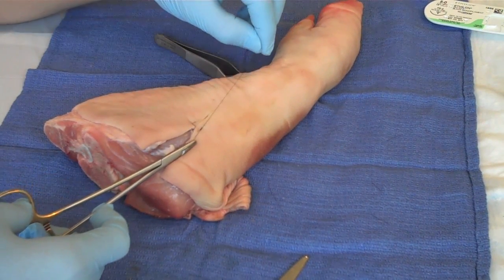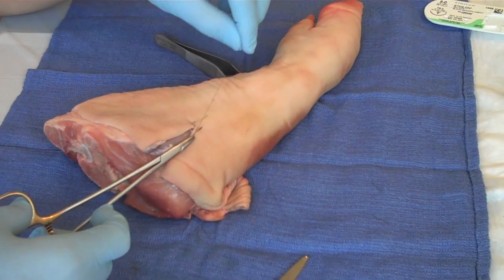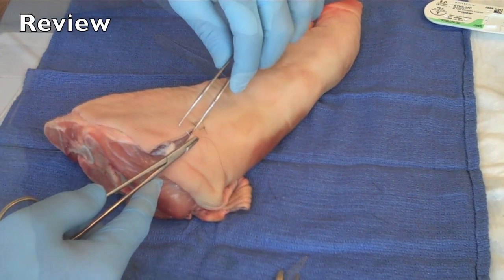And that is the horizontal mattress stitch — used for complex wound repair.